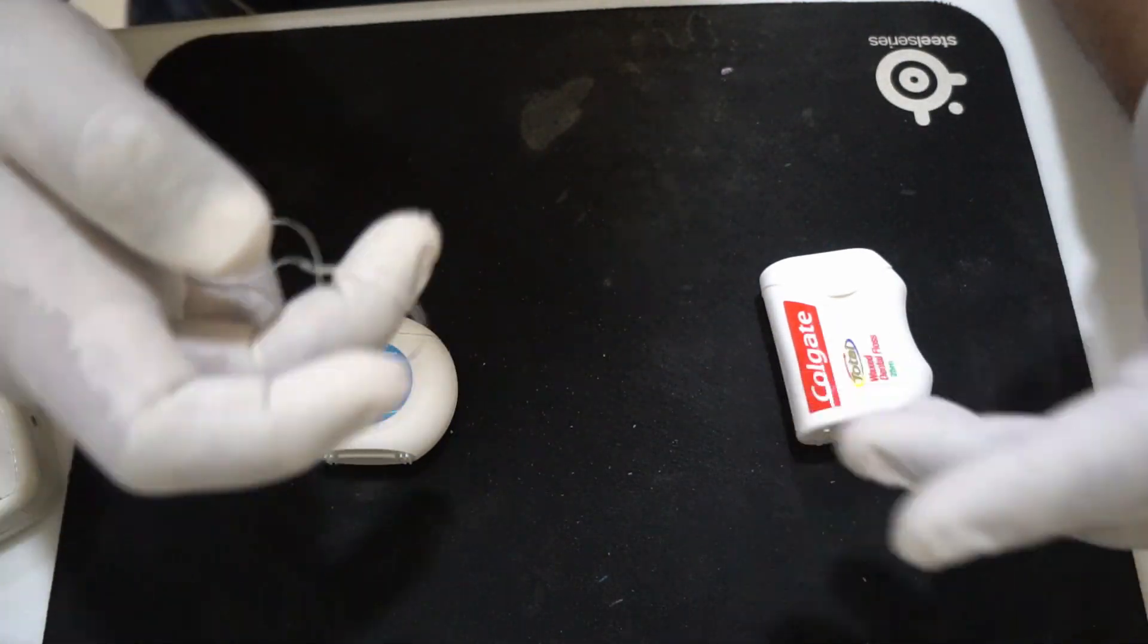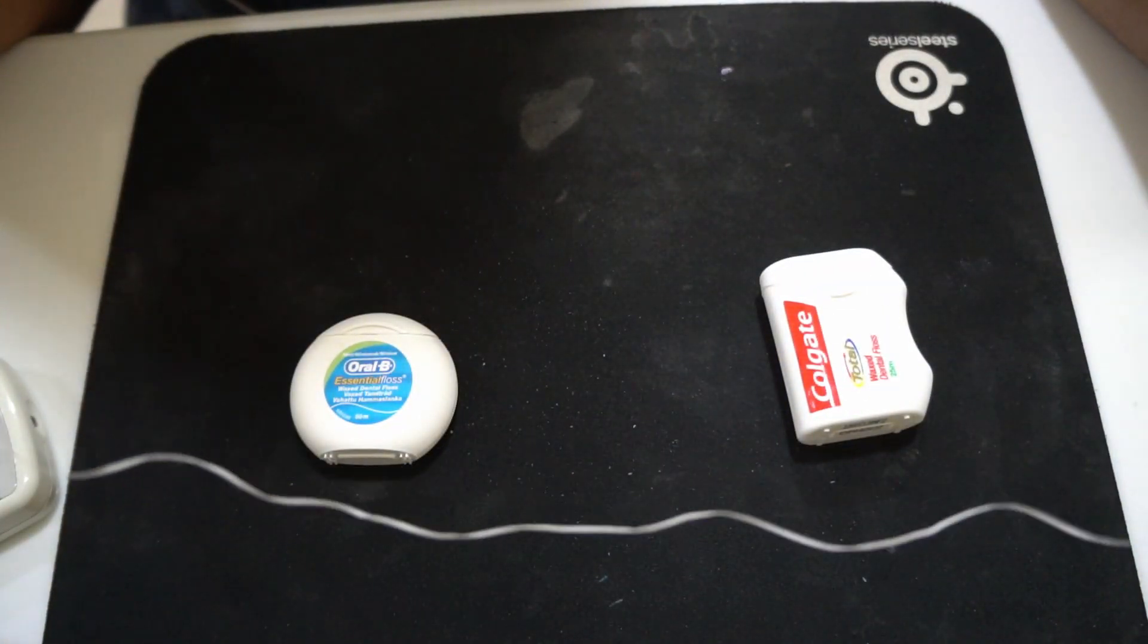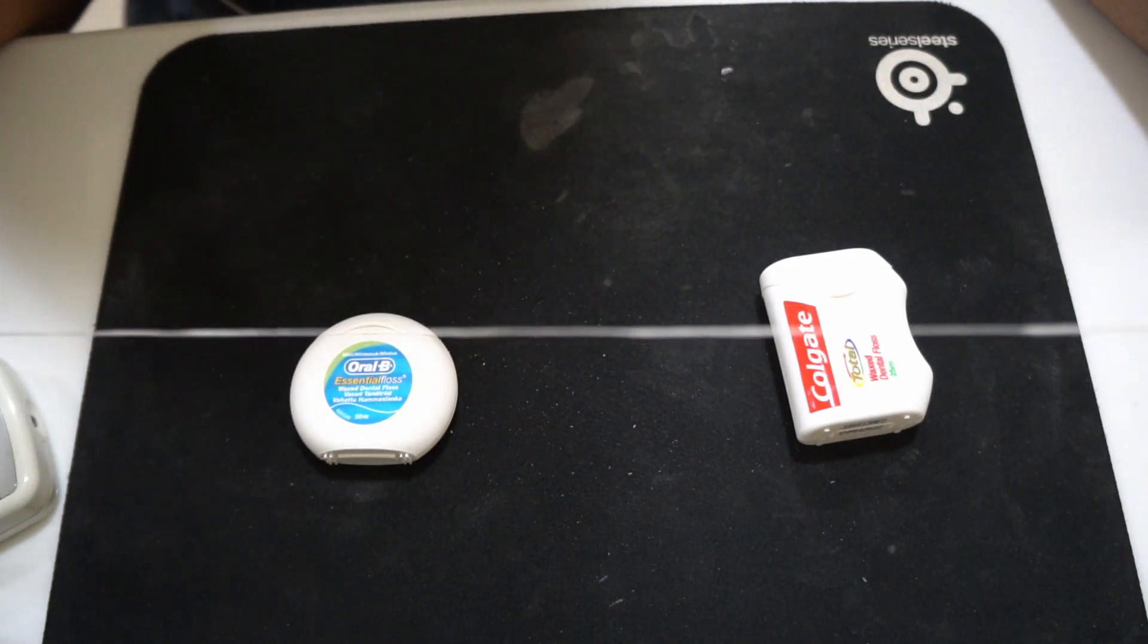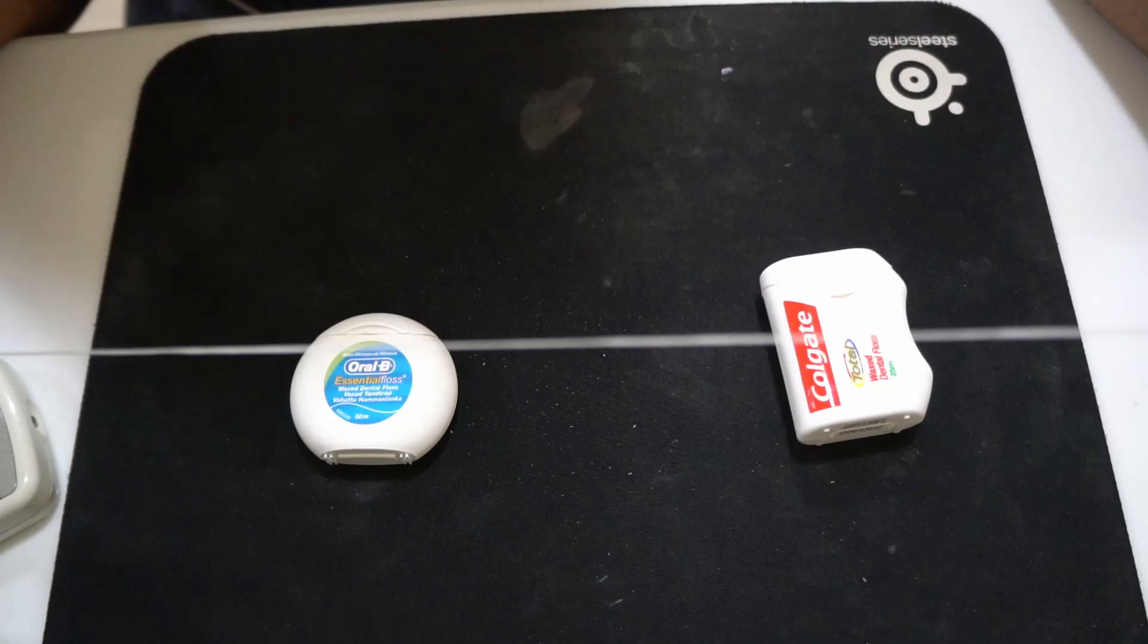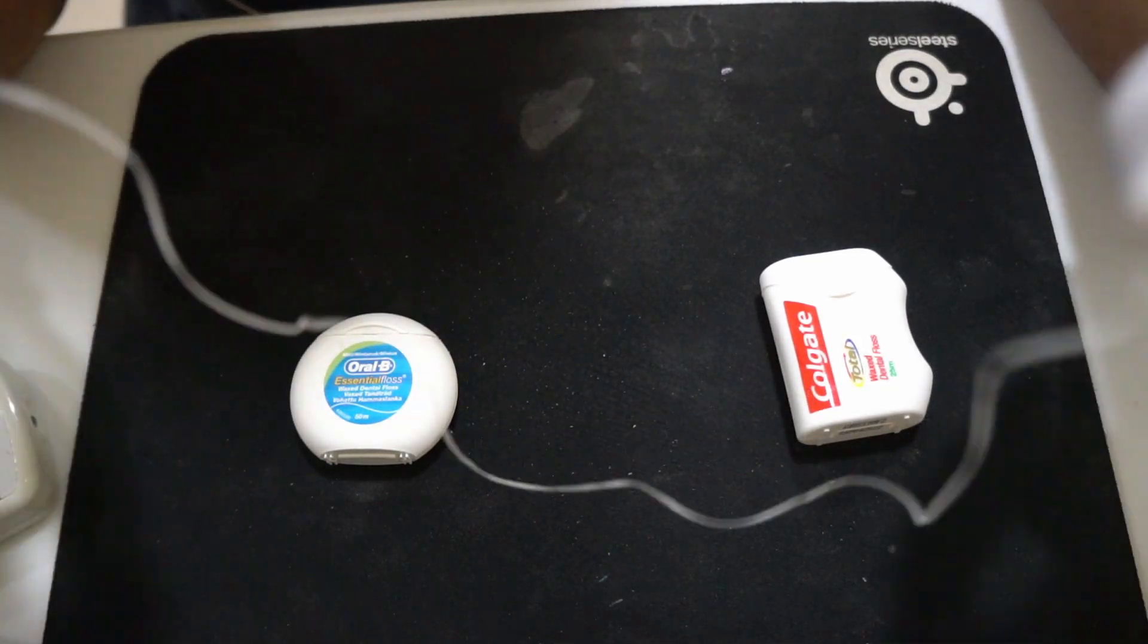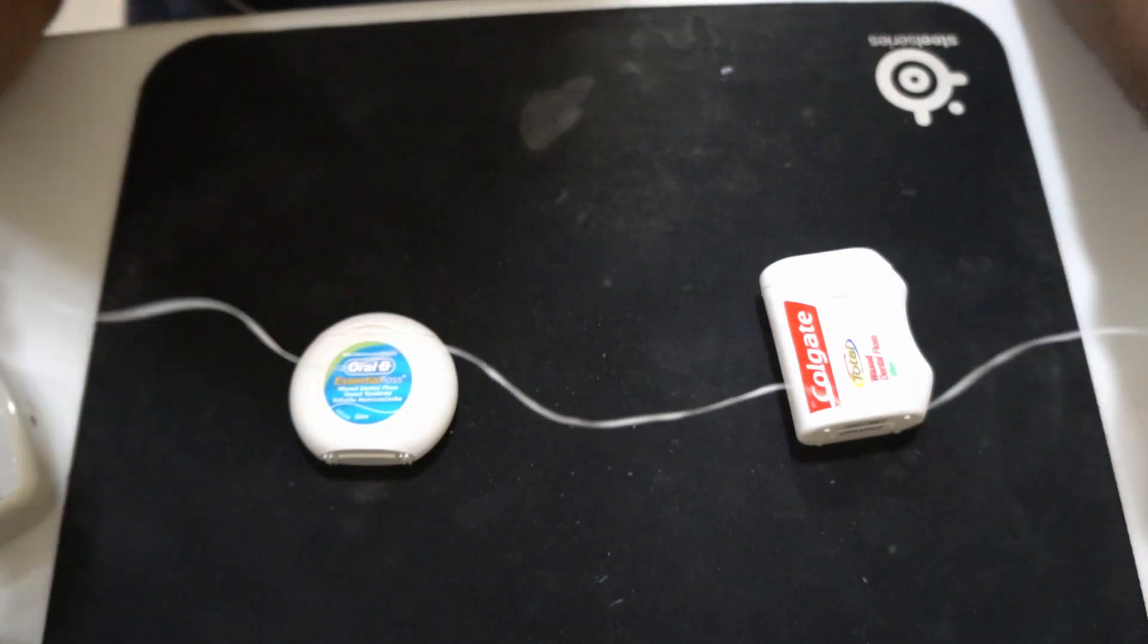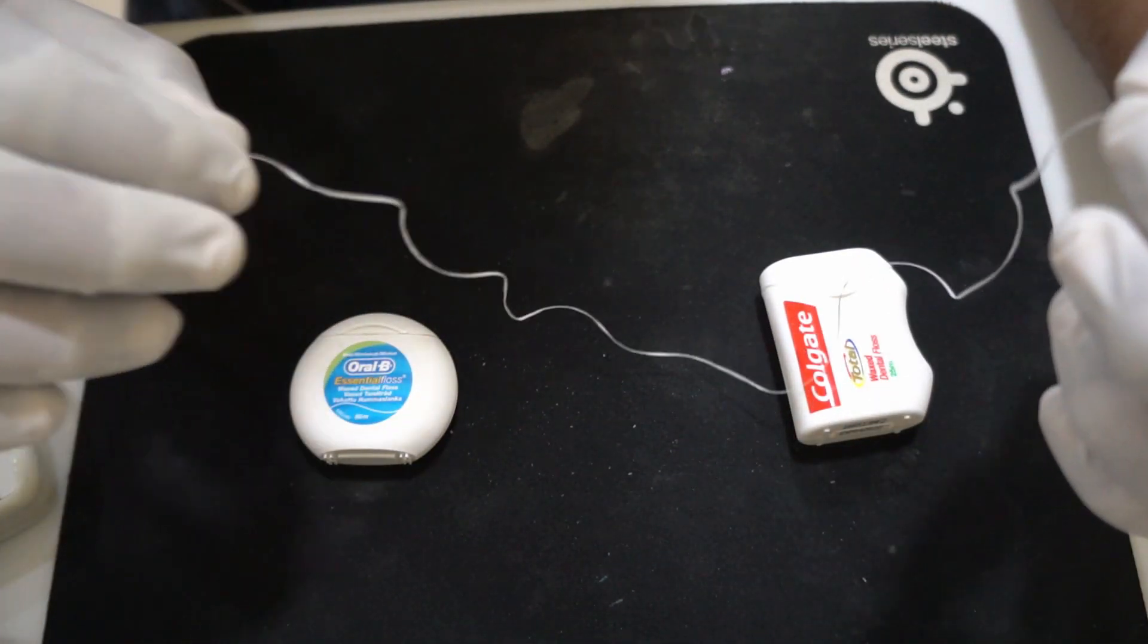So any one will do. If you are a beginner, just start with about 15 cm of the floss. As you get used to it and get more experienced, you could probably get away with taking a shorter length of floss. But to begin with, take a longer stretch of floss for your floss ligatures.